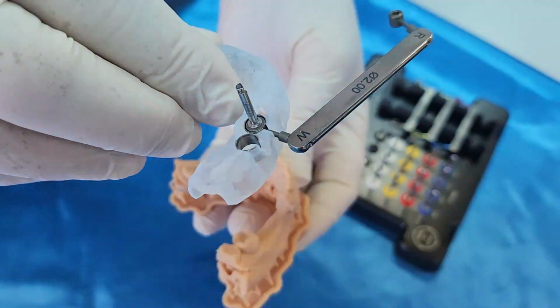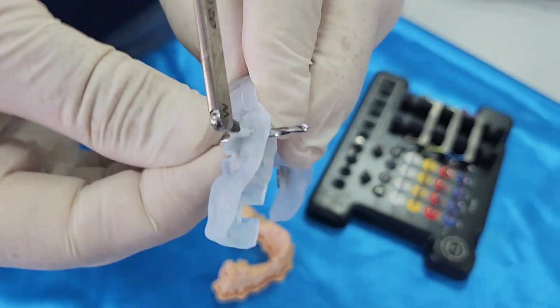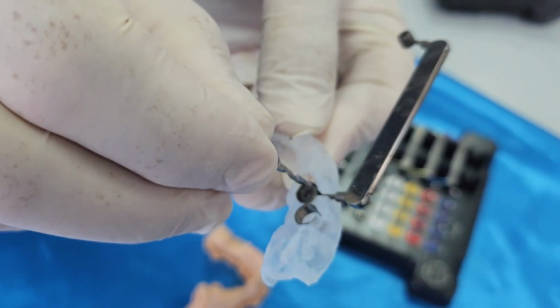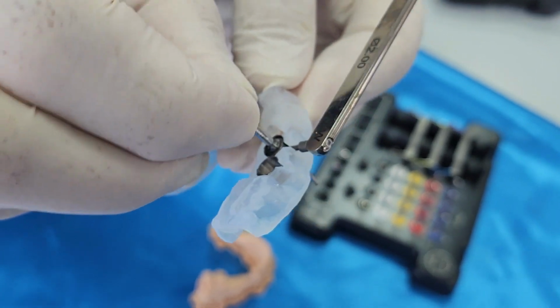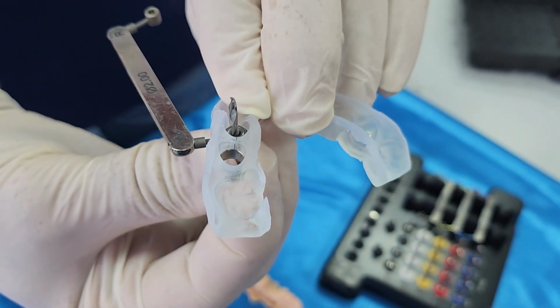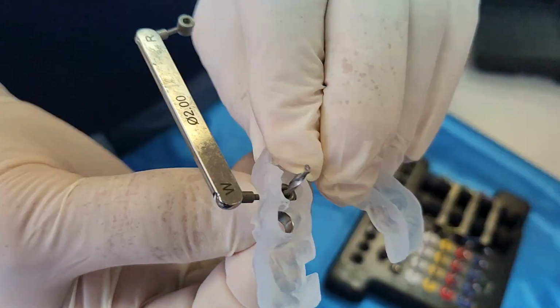As you will see, I remove here, and you see that the drill is going to come here. What is the size of the drill? It is based on the guidelines which are delivered, including with the guides. So we are going to drill and show you the result.